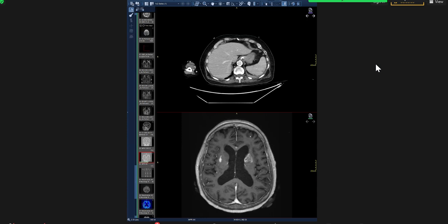Then the other causes that could bring on bilateral basal ganglia abnormalities that you have to be really aware of is carbon monoxide poisoning, right? So carbon monoxide poisoning, methanol toxicity, these are the things that can give you bilateral basal ganglia abnormalities. Other than that, this was infarcts, okay? And then you have other differential diagnosis, which is the hypoxic ischemic injury, which is extremely important.